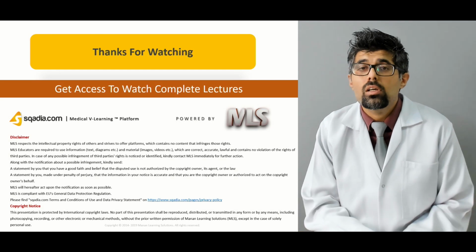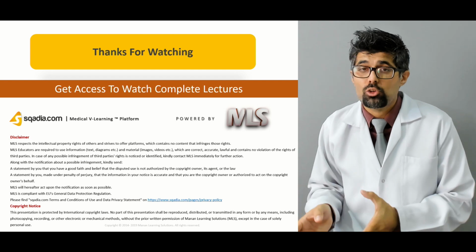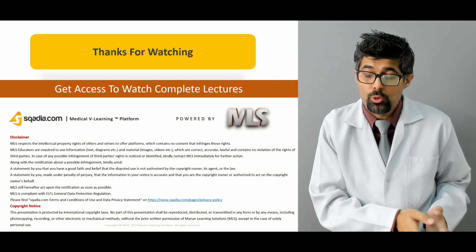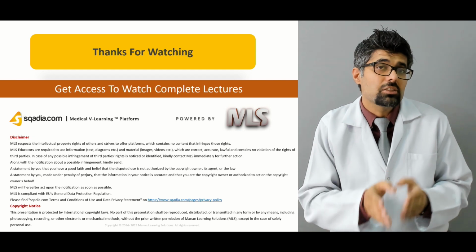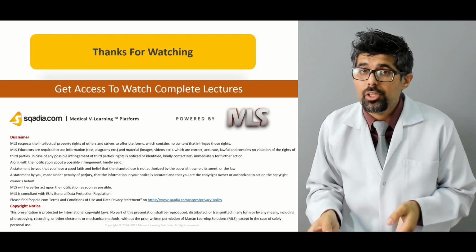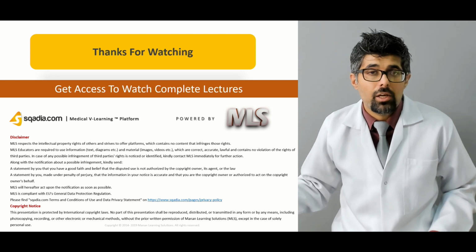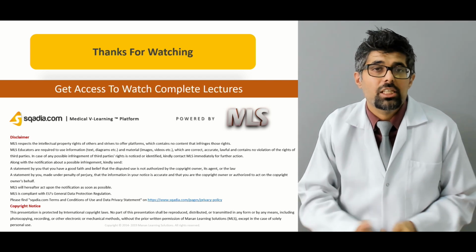So what did we learn? We learned about the chest trauma. We learned that chest trauma is always an emergency, and the choice of modality to use during that emergency is not only time critical, but it is vital to the patient care. We learned all the modalities from HRCT to CTPA to contrast enhanced CT scan to plain chest x-ray.